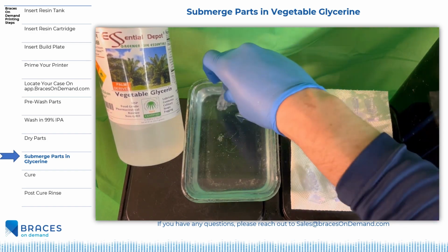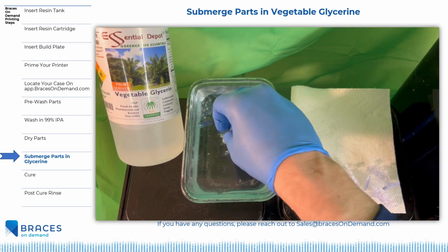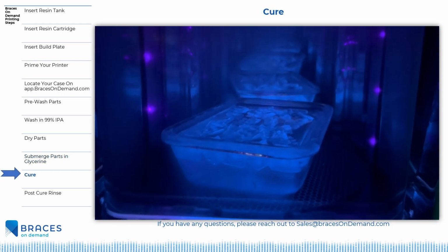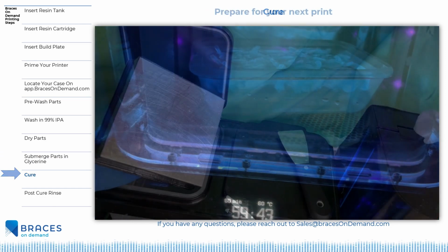After 30 minutes, submerge your dry parts in vegetable glycerin while curing. Glycerin aids in a uniform cure and greatly reduces water absorbency. Glycerin is key for your bracket to become stain resistant. Cure in glycerin using BOD's recommended cure time and temperature. For Biomed Clear, cure for 60 minutes at 60 degrees Celsius.